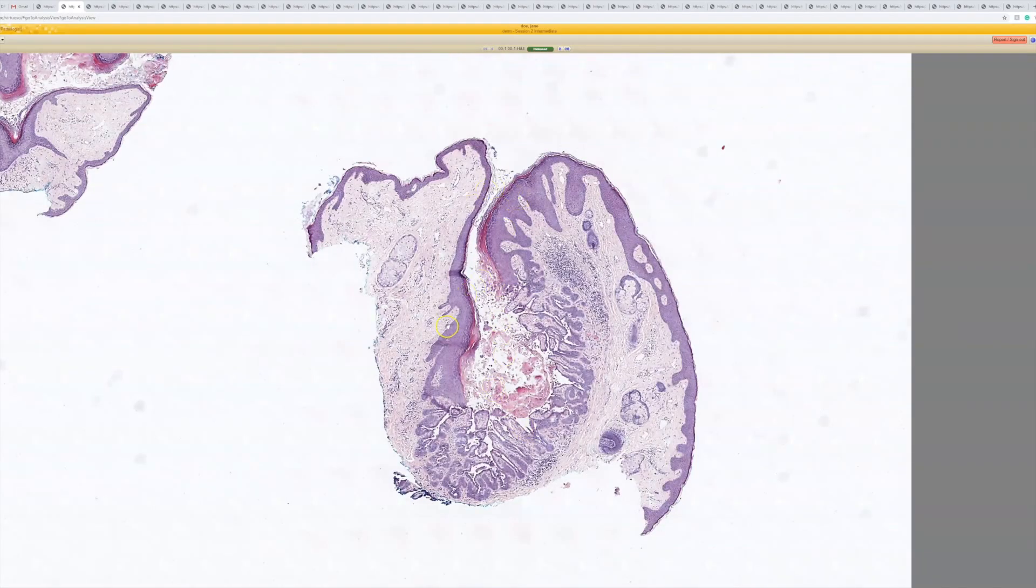like an invagination, or sometimes it'll look totally like a cyst, because remember, anything that's invaginated that has an opening to the surface, like a punctum, like you'd see in a follicular cyst, epidermoid cyst, whatever. If you cut straight down the middle, you might get a cut through the punctum and get to see the opening to the surface.